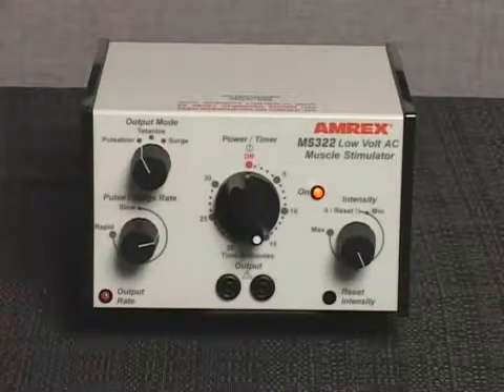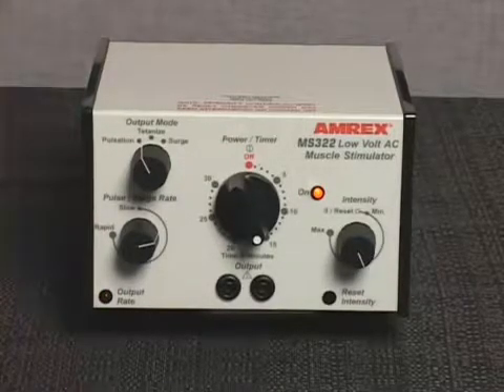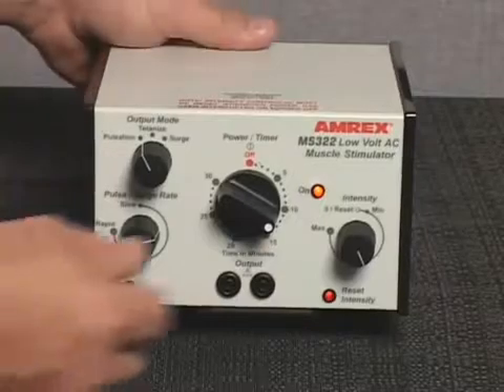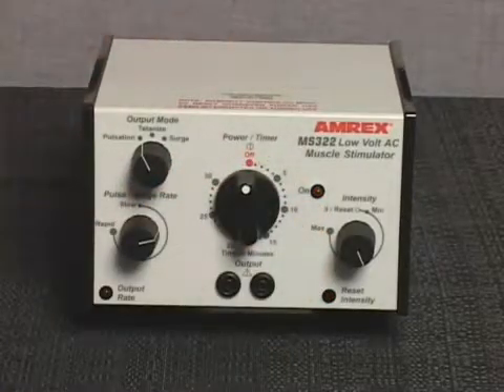If desired, select an alternate output mode of pulsation or surge and adjust the pulse surge rate control setting. The output rate indicator light or lights will reflect the output rate selected. The AC power will shut off and a bell will sound when the treatment duration is completed.